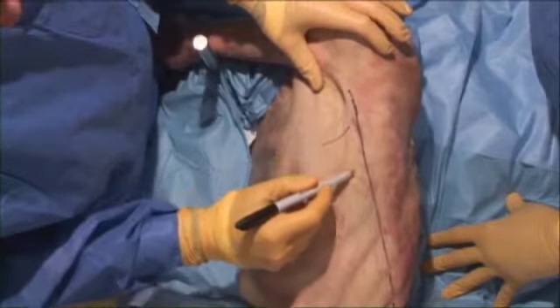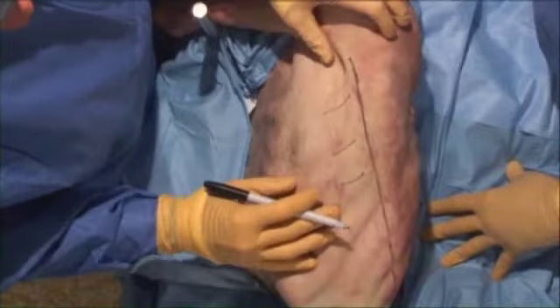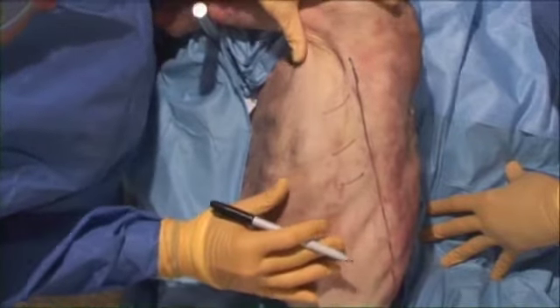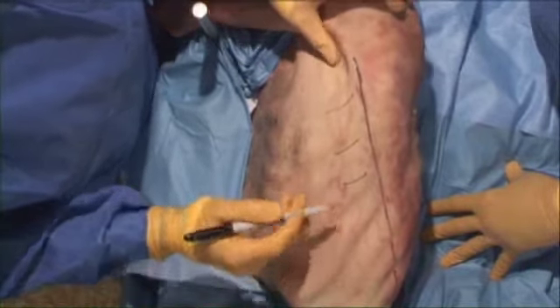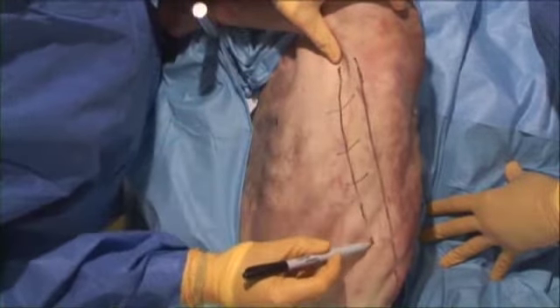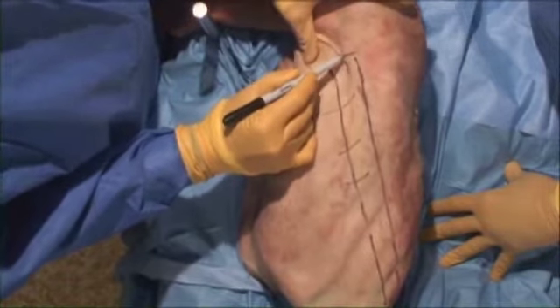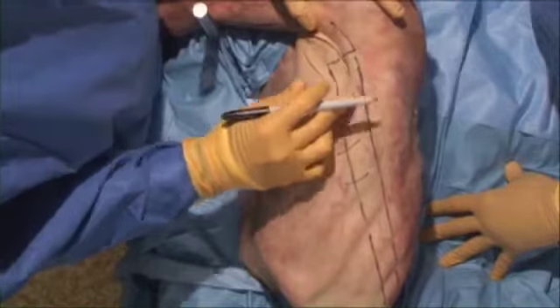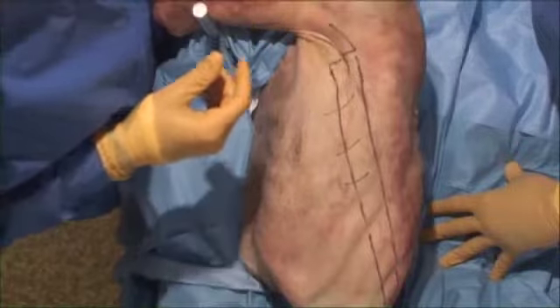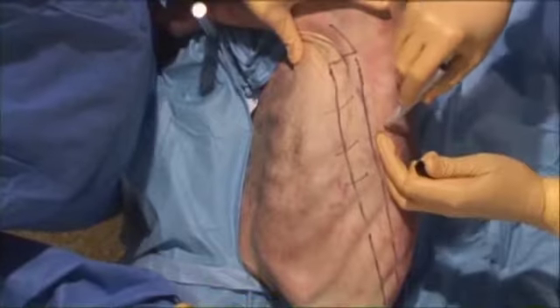The serratus will be coming in this way, and the idea is to be able to preserve the serratus and the latissimus and still pull it off the chest cavity and have access to the front and the lateral portions of the majority of the ribs. So an incision generally paralleling the latissimus to be able to get access to the serratus. You can extend it through the arm if you want to gain further exposure. And that defines the front latissimus sparing incision.